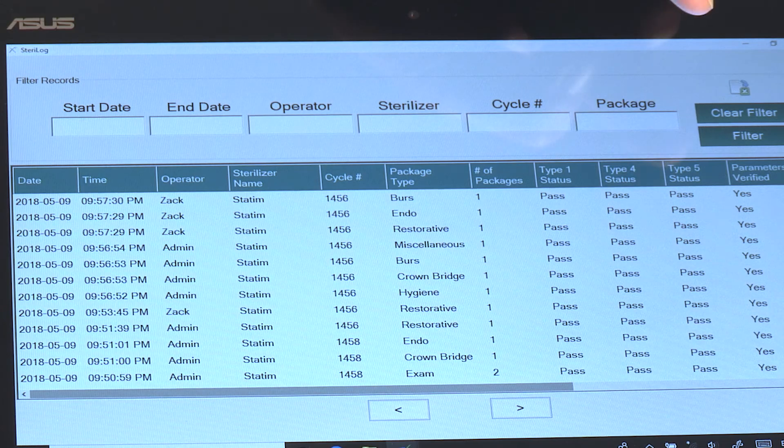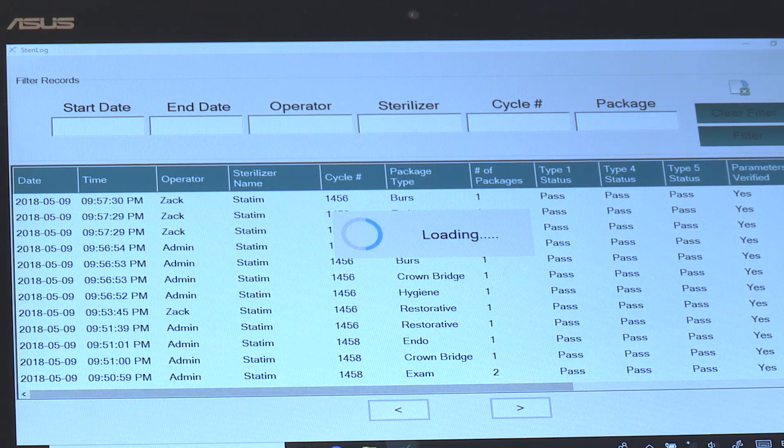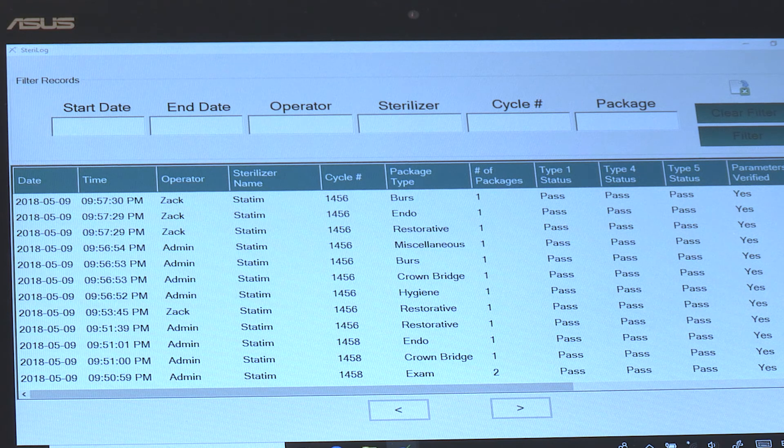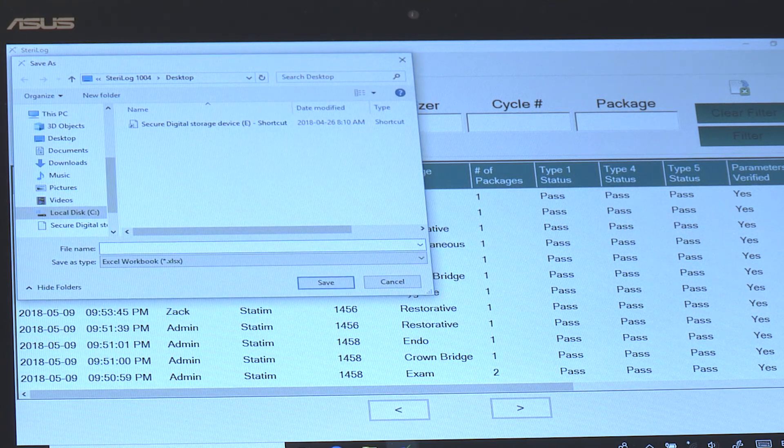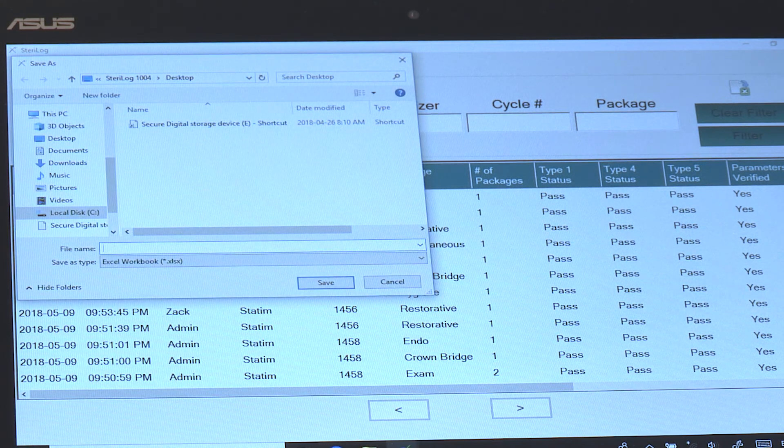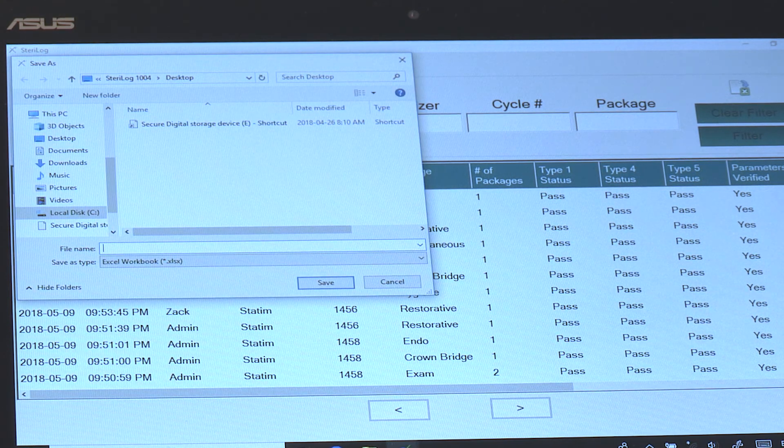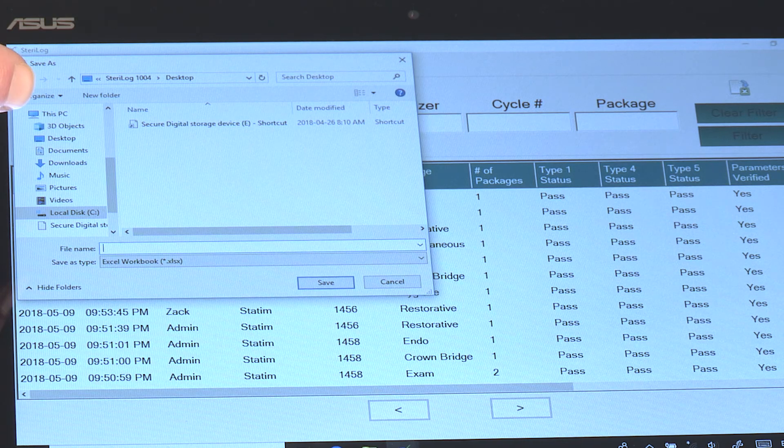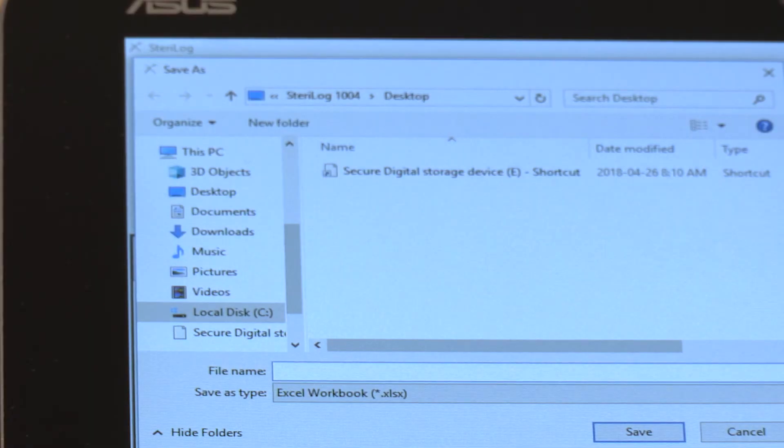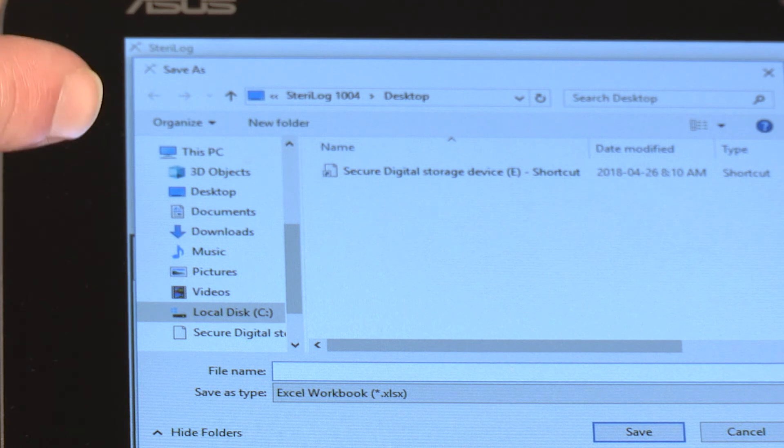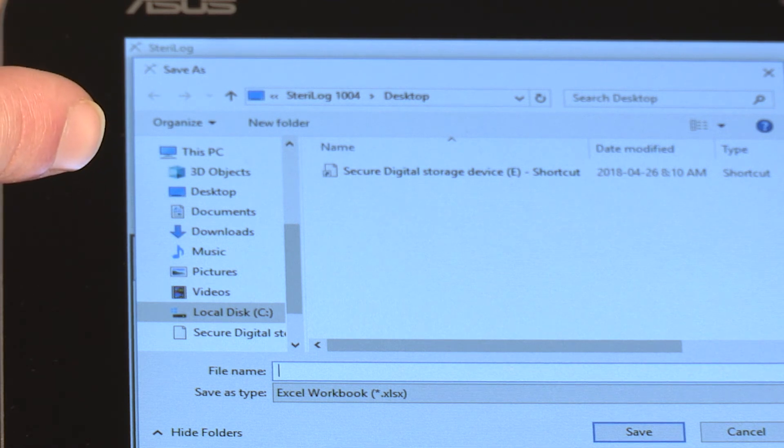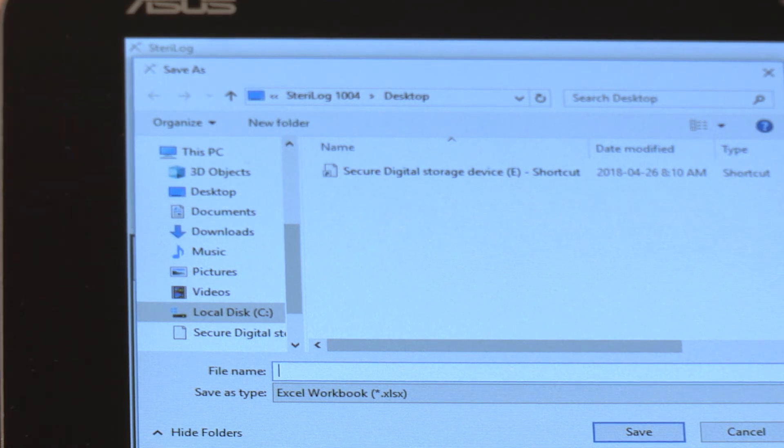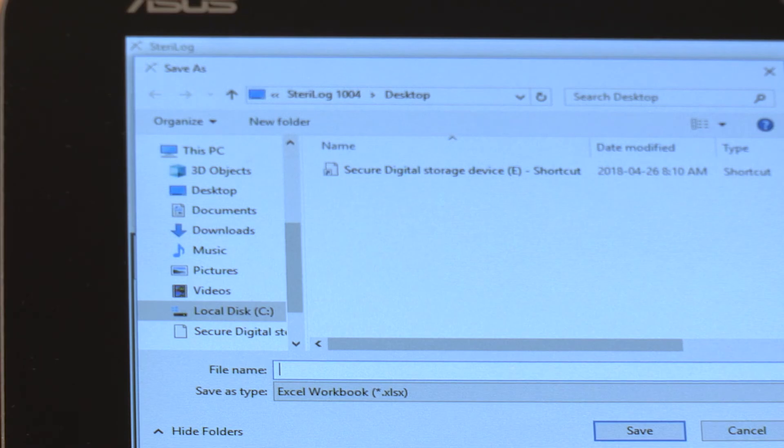To export this log to Excel, simply hit Export to Excel, key in the name of the file that you'd like to set up and a location. You would name the particular file that you want and select a location for the output Excel file, and then simply hit Save.